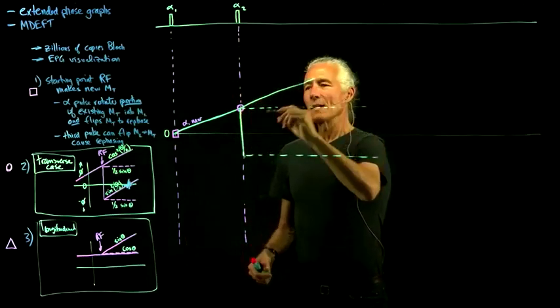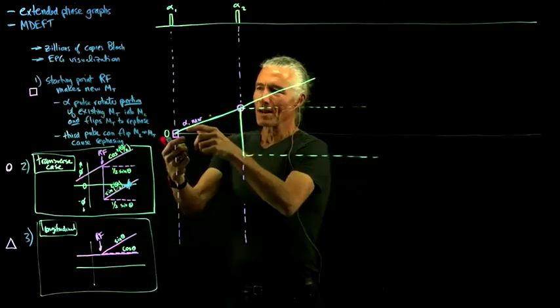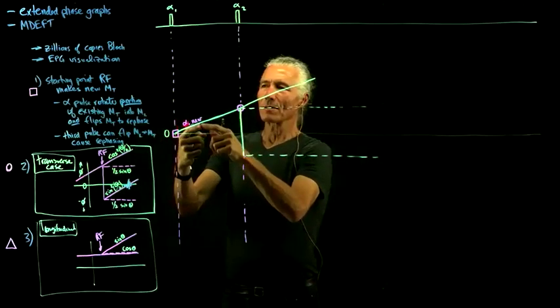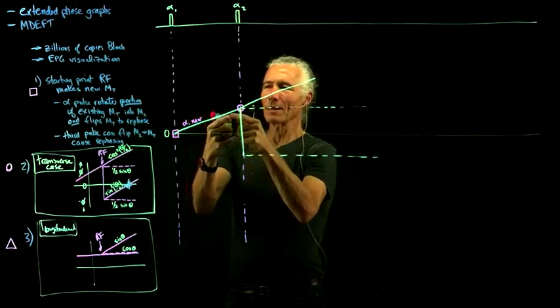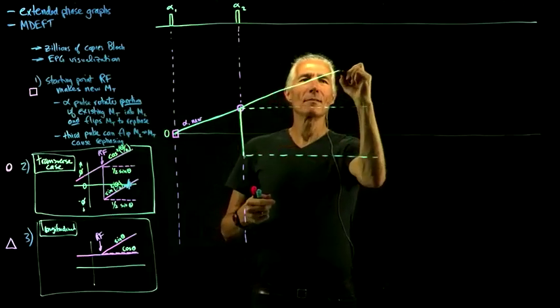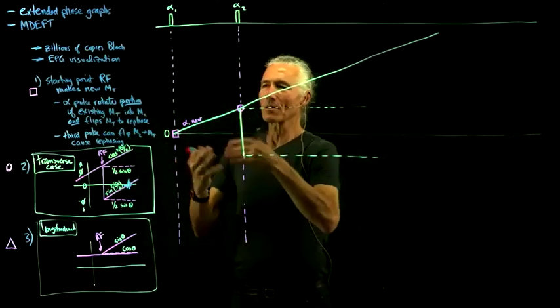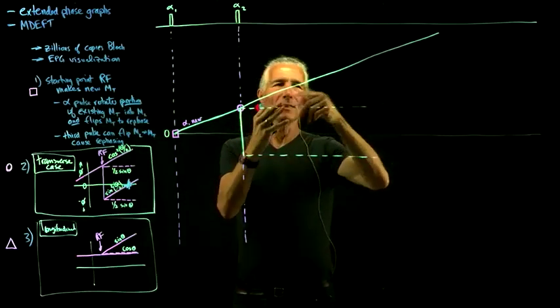and as you get further and further, the phase just wraps around. So what happens is, initially everybody's lined up by the RF pulse, and then as the phase gets worse and worse, it gets spread around the circle, and then it gets spread around the circle twice, and then 3 times. It just keeps going, and so that's what this line represents. It means we're just getting worse and worse and more dephased. As soon as you spread all the way around the circle, everything is already lost. But you can continue respreading around the circle and just getting worse and worse.